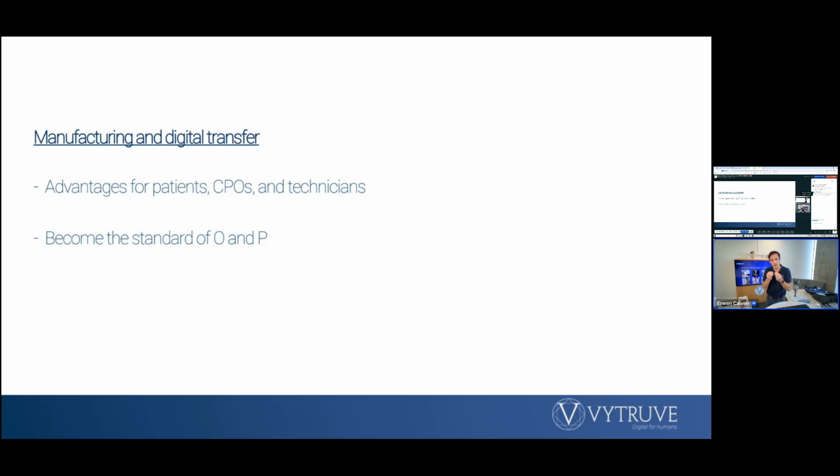And it's a game changer. For the CPO, it's very, very nice. For the technician, it's also very nice because you give your technician the best tools. It's not heavy. It's not necessary to put it in the oven. So for the technician, it's also very great. And for the patient, it's necessary to come back on the patient. It's very nice because you give him a very good socket, a very good process without problem, because the patient will keep the check socket.